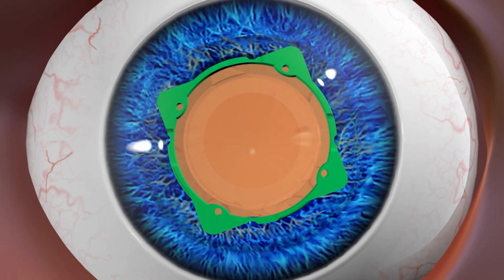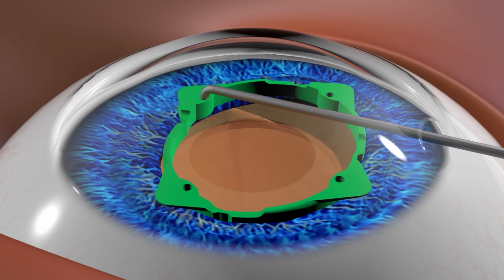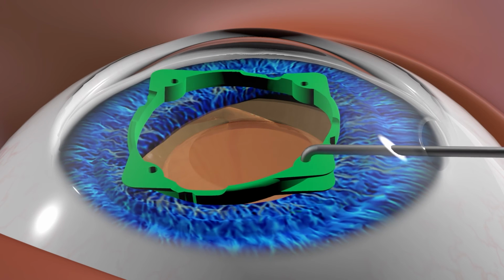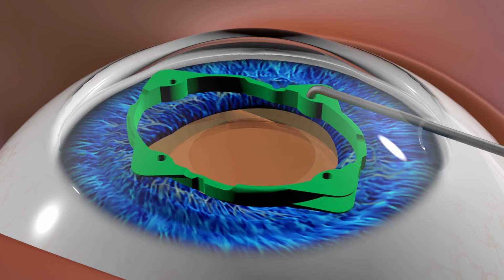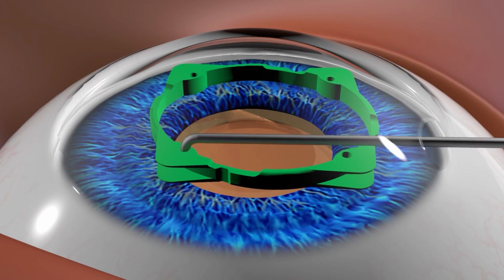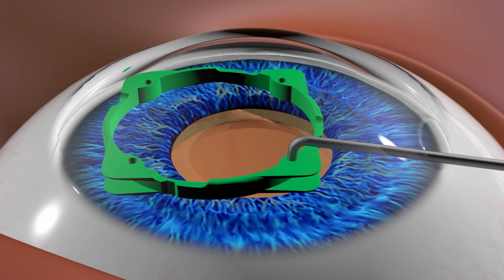To remove the ring, first disengage the four channels using a Sinsky hook. Always begin with the distal channel, followed by the proximal channel, and finally, the two lateral channels. Align the proximal hinge with the primary incision and position this hinge away from the pupillary margin.